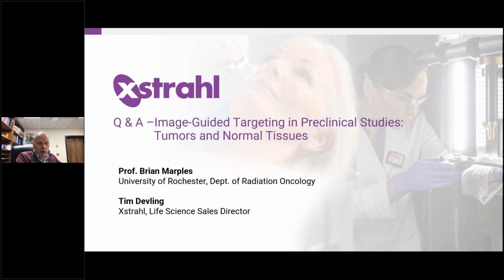For a fiducial marker, once it's implanted, then you've implanted it, and therefore you use it every day without any concern about injection of contrast. However, the fiducial markers have to be surgically implanted.